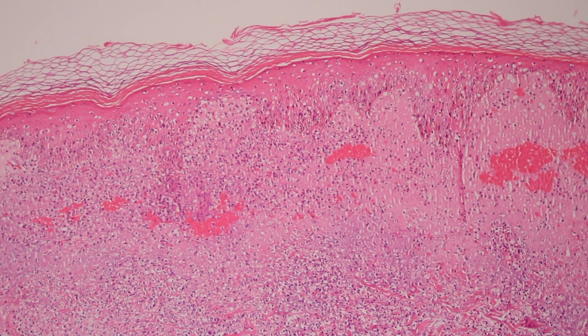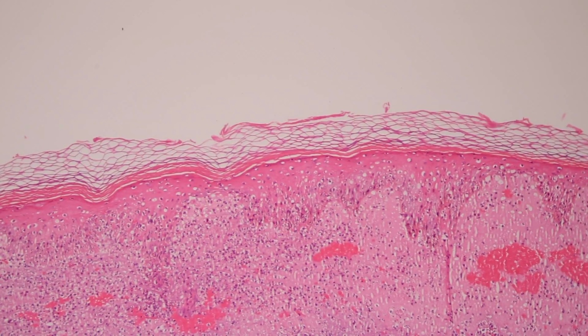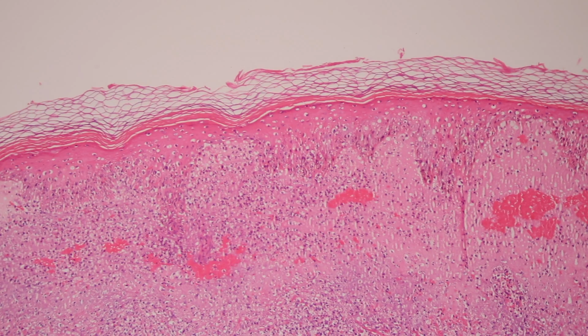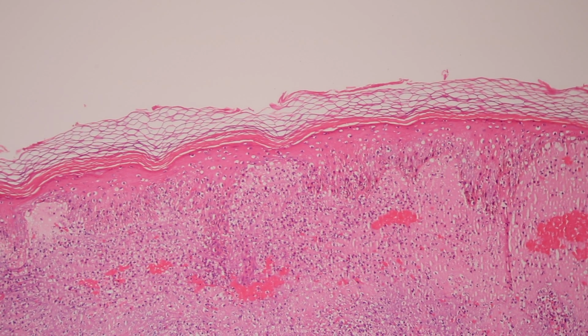Even though this is a bit of an older slide that's washed out, if you compare, here's the normal epidermis, you can see that the washout is not actually from an old H&E in this case. The washout is these cells are losing blood flow and dying and degenerating. So this really pink, washed out, or ghost-looking epidermis, this is what happens from ischemia.